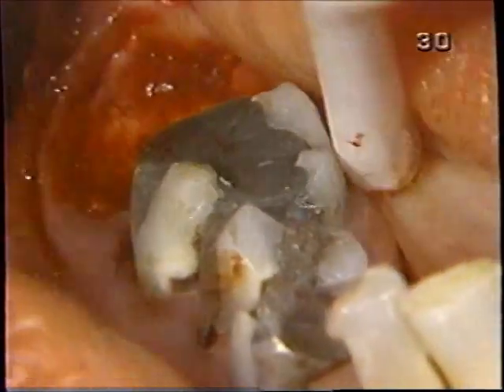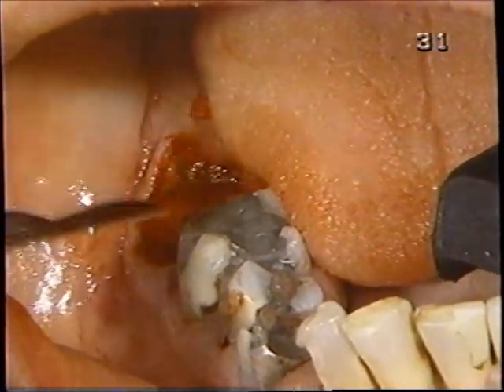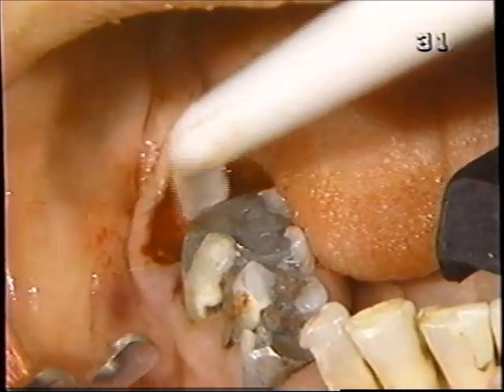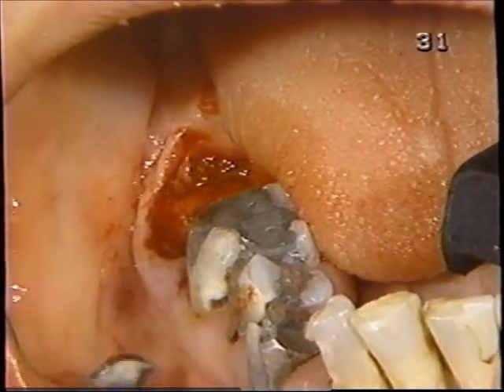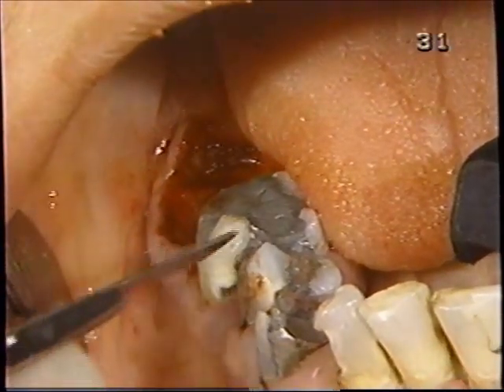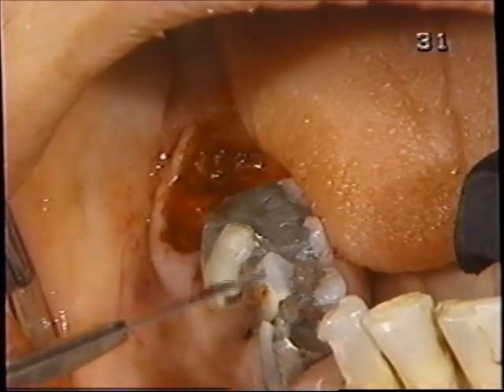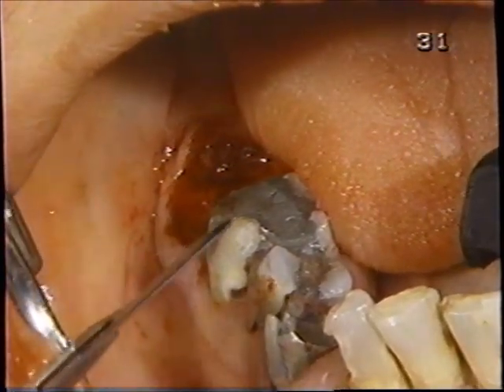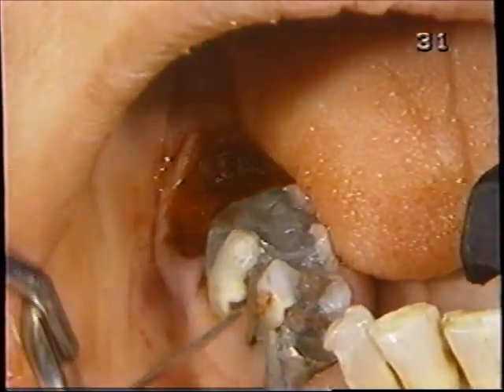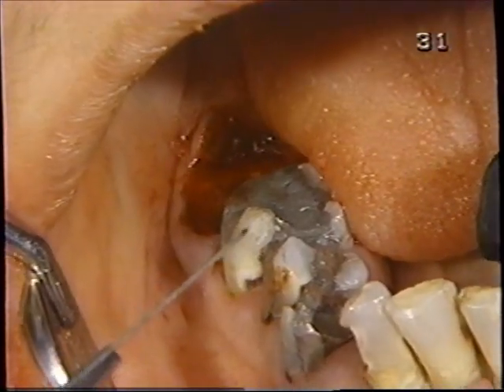It's not working. We're going to have to reflect the flaps. Okay, in order to have access and visibility of this mesial root of the second molar that's fractured fairly deep, we're going to reflect a triangular flap. Now the question is where? Ordinarily it's one tooth away, and by that criterion it would be right here. But we're going to be taking out this tooth in a few minutes, and we may need a flap for it. We can complicate things unless we plan for that contingency, so number 28 is going to remain.